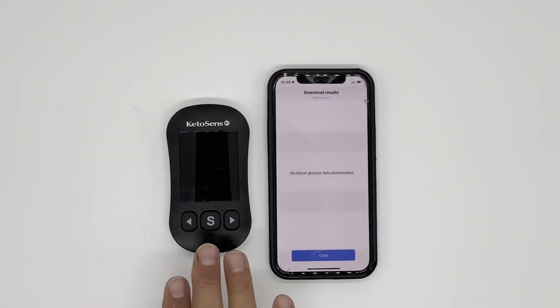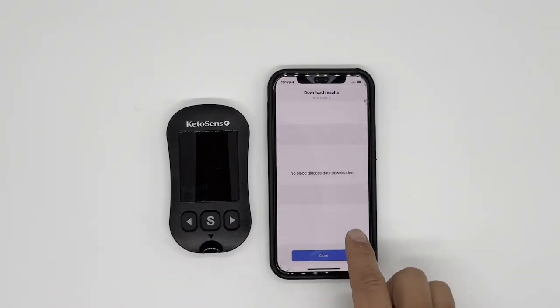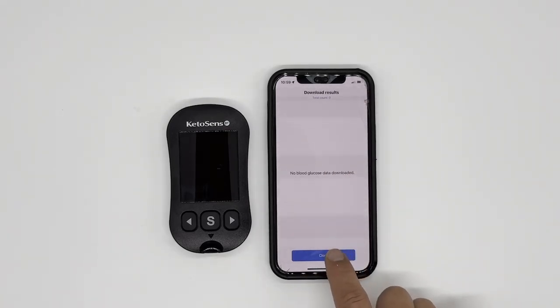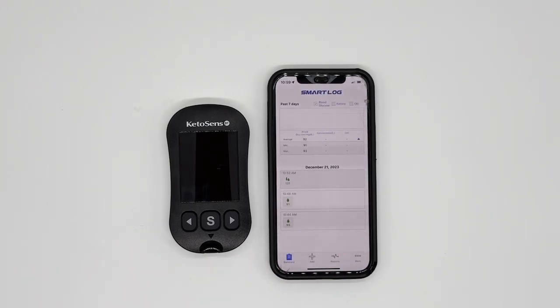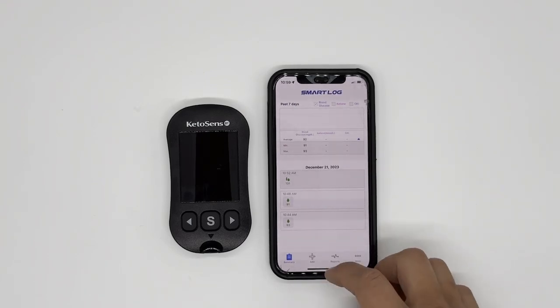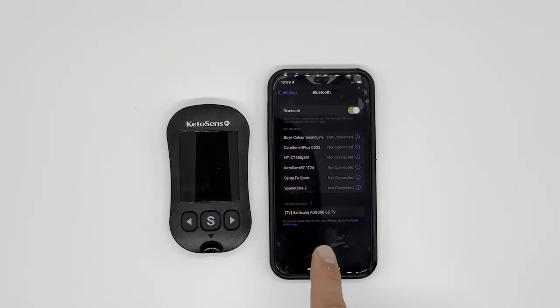If you don't have any data, you'll see an empty screen. If you do have data, you would see results here. Now let me show you how the data actually gets transferred. When you measure and take out the test strip, that action triggers the Bluetooth signal. So if you go to your phone settings, you would notice that KetoSense BT — for example, 1724 or whichever your serial number is — says 'not connected,' because it is not currently triggering any Bluetooth signal.